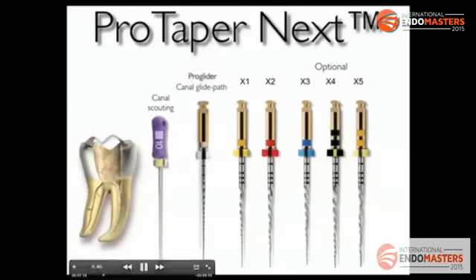We can also include a ProGlider. Instead of the two path files, we can use the ProGlider file. It's the same, we change two files for one. I love the ProGlider because with just one instrument we prepare the road, the highway for our Ferrari, in this case ProTaper Next.